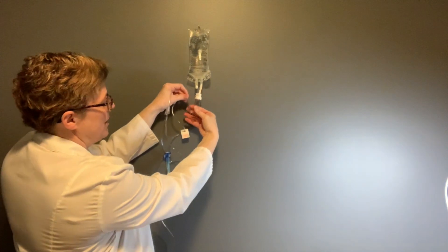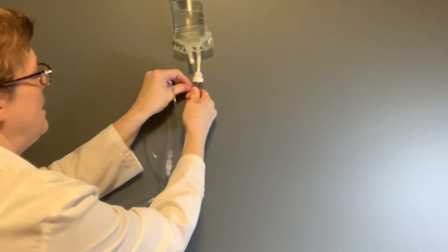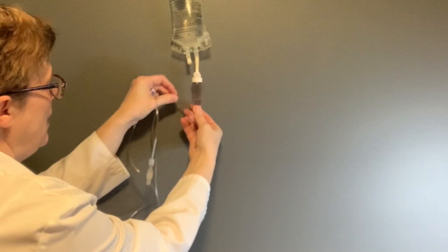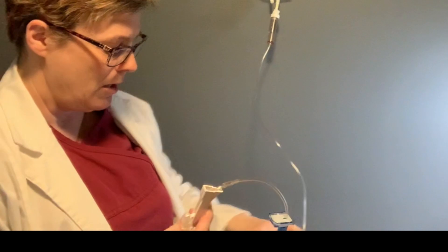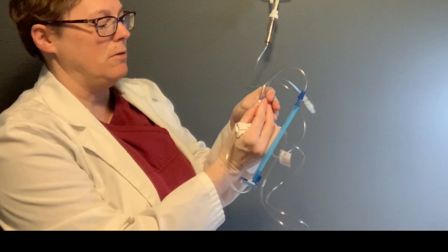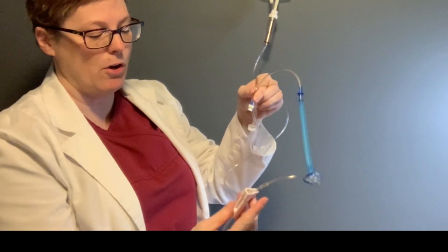I'm still holding this tight. I gave it a squeeze and filled in the fluid chamber. Now I'm stretching this out and I can see there is a bubble in there, but that's okay — it's going to come out. Now we're going to open up the clamp. If you have Y-ports, hold those Y-ports upside down so that as the fluid primes through it will fill the base first and then carry on.